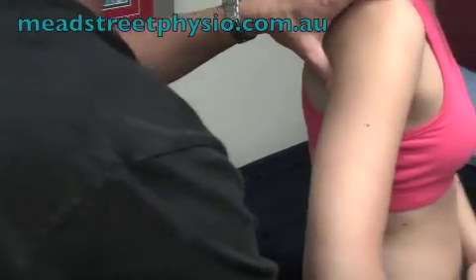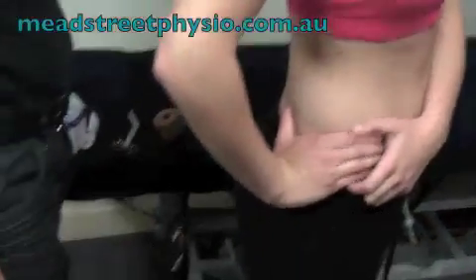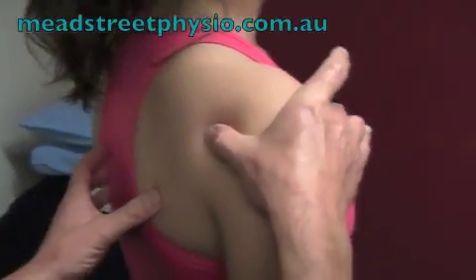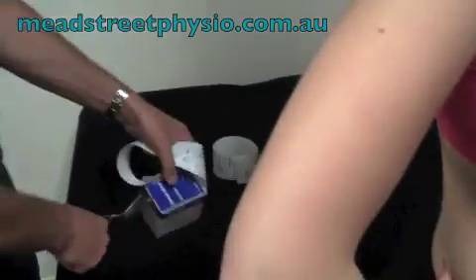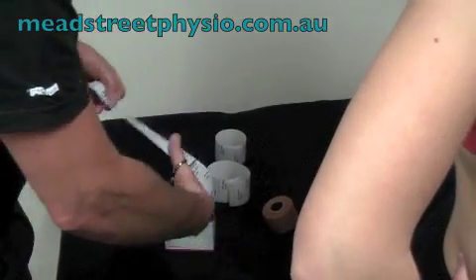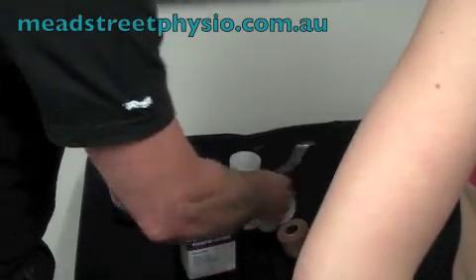When we tape the shoulder, Jess is going to position her arm in here, and that allows the shoulder to sit in a nice comfortable position, allowing the humeral head to sit in its glenoid socket in a neutral position. So let's take that up now with some Fixamol. I usually just cut off a few strips and apply that to the skin.